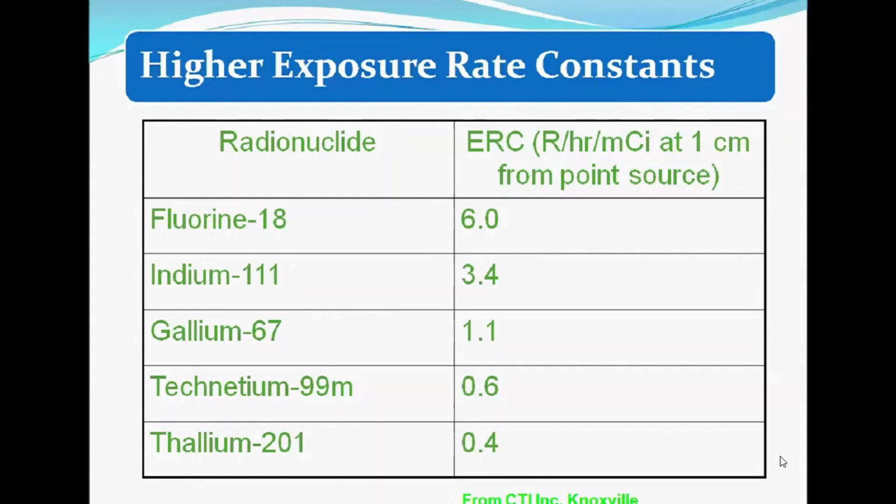Otherwise, if you take proper time, distance, shielding, the way we work, where shielding is required, then you need not stay for a longer time. Then you have to work behind the shield, the movable shield or fixed shield. In the same way, you have to maintain a safe distance from the patient, and you must ensure that the patient does not get scared by your maintaining a very large distance. Every inch is significant while maintaining a safe distance and time. Whatever time is needed, spend the required time and move away from the patient or the scanner room.